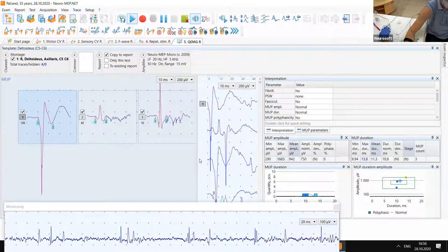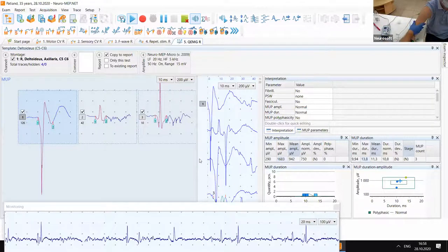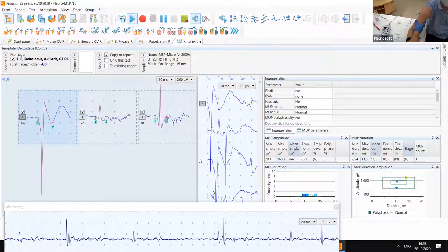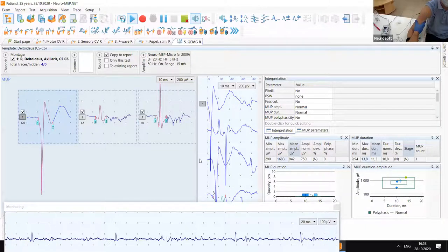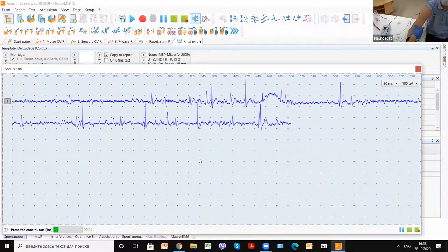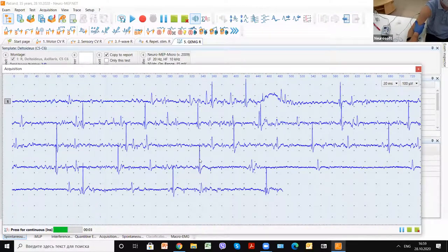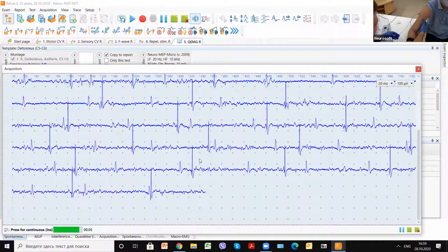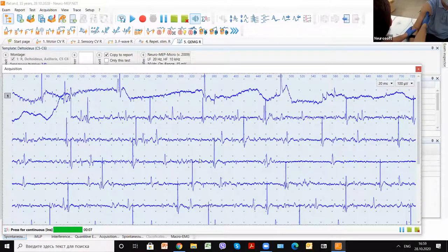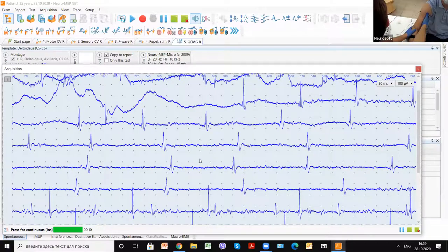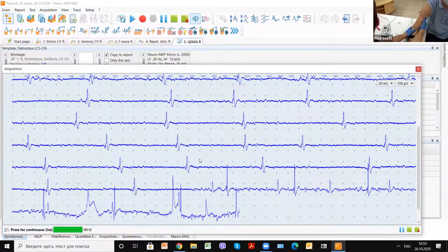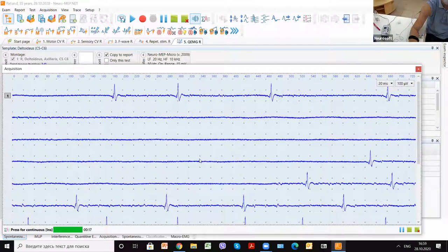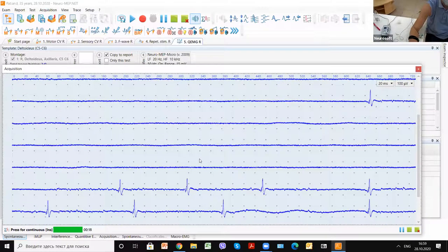After that, we will again ask to relax completely. It's better. We again can estimate the position at relax.